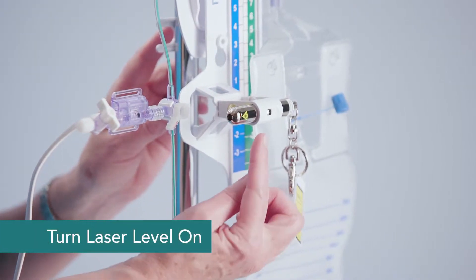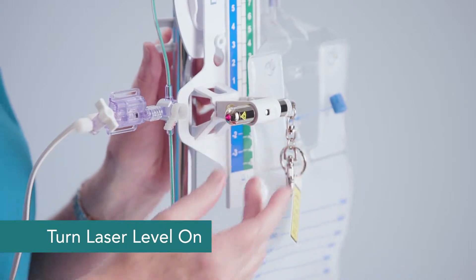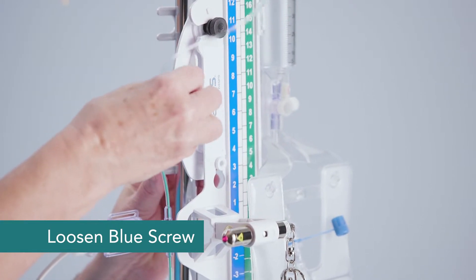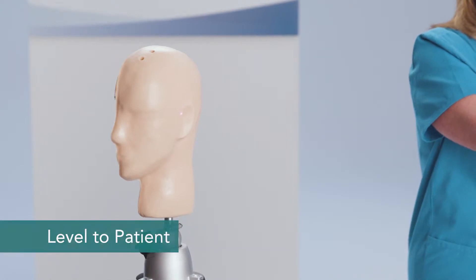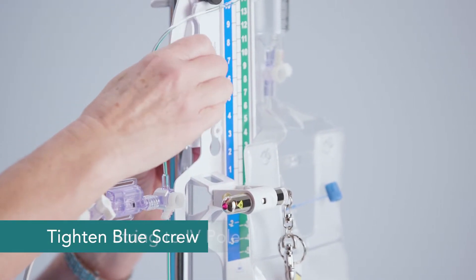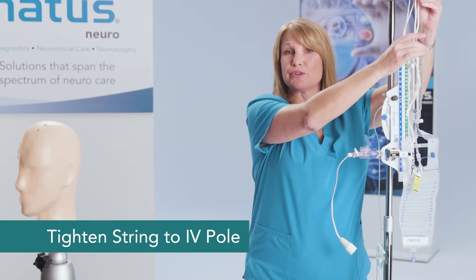To turn your laser level on, you simply depress the button on the front of the level and that projects a beam of light. In order to move your drain up or down, you'll use this blue screw, and you can see how it moves up or down. You'll want to level that specifically to the patient. Tighten your blue screw and then tighten again with your string so that your system is securely into place.